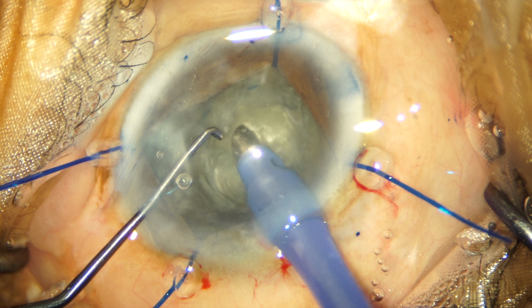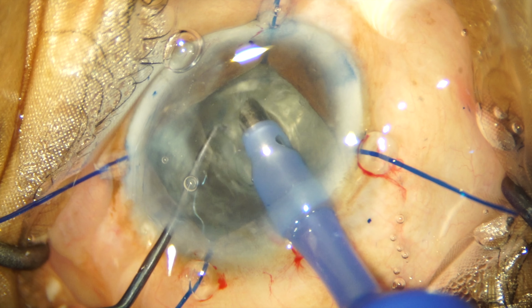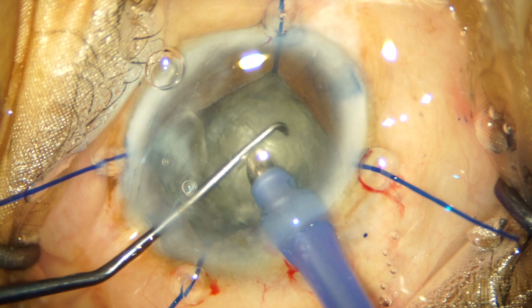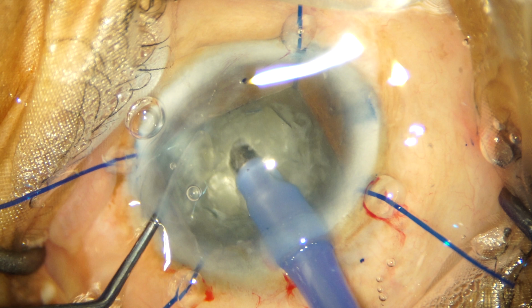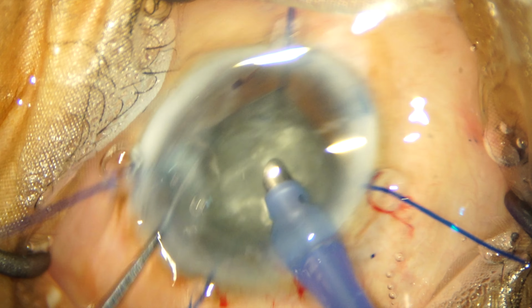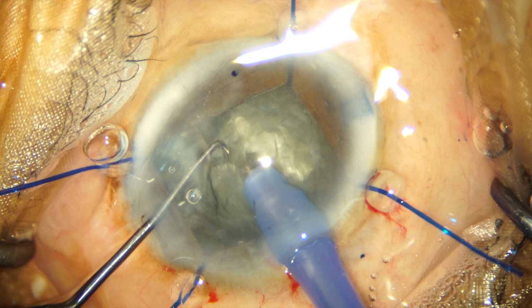The technique of choice in a nuclear fracture for pseudoexfoliation cases is a direct chop. As you can see here, I inserted the phaco tip bevel down and I failed to achieve the chop in the first instance, so I rotate the nucleus by 180 degrees and try from the other place. I lose hold of the nucleus once again and I try a third time.